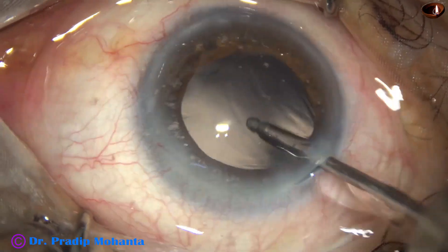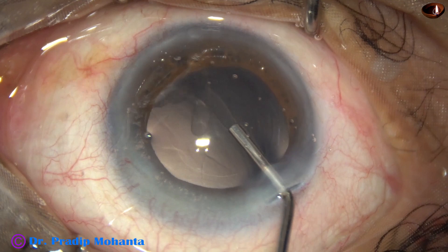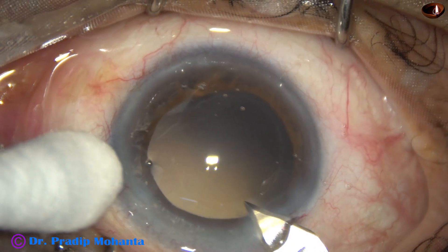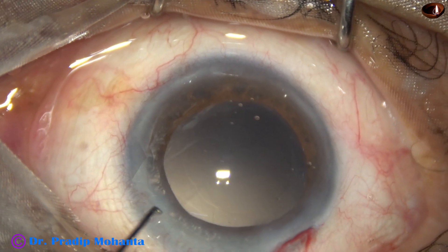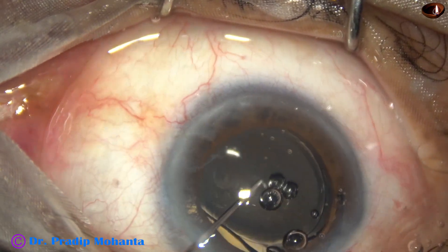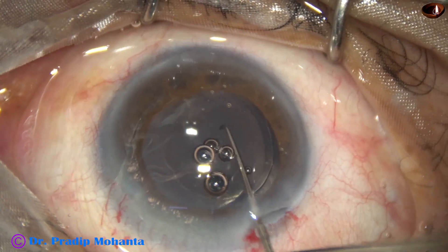An irrigating probe is used for polishing of the posterior capsule. Then the anterior chamber and capsular bag are filled with 2% hydroxypropylmethylcellulose. The main wound is enlarged by 0.2 mm from 2.8 mm to 3 mm, and a single-piece monofocal intraocular lens is placed in the capsular bag. Now it is time to inject more viscoelastic and enlarge the rhexis.